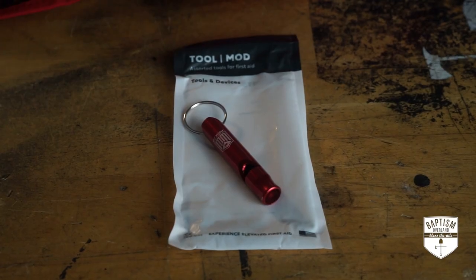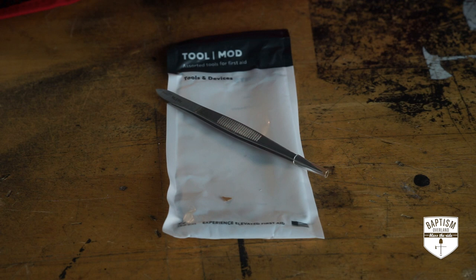There's a whistle — if you're in trouble, whistle. There are also tweezers, which are good for grabbing small things, but not really good for holding tissue.